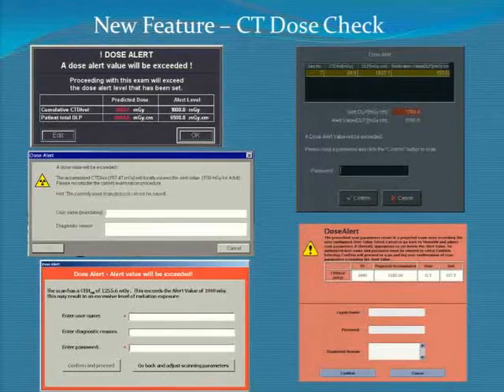So what happens in a clinical exam, and for us, this only really tripped during neuro CT perfusion, because you do a no contrast, a with contrast, that's the whole cine run, and then very often some angio runs after that. And so it's a lot of exams, and you can get up to that 1 gray total.